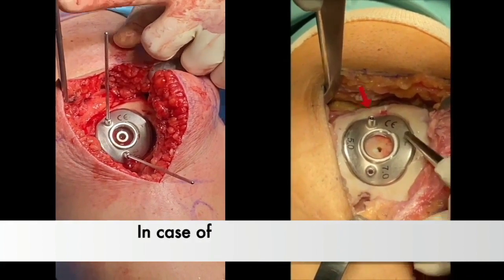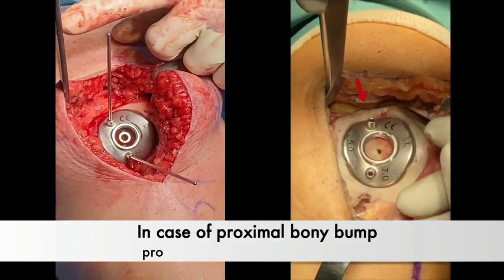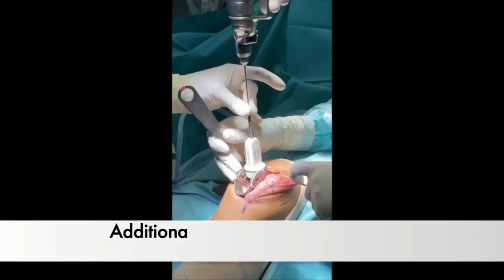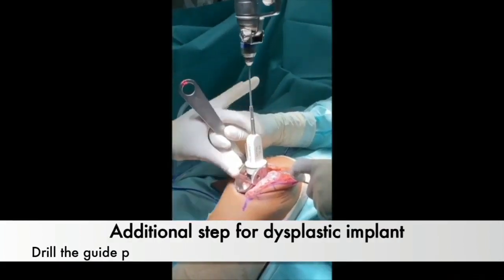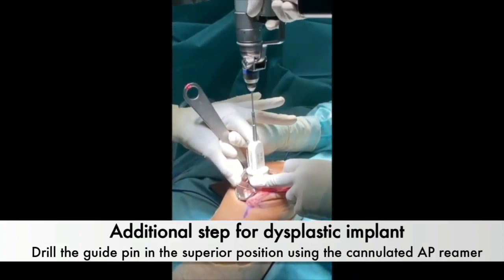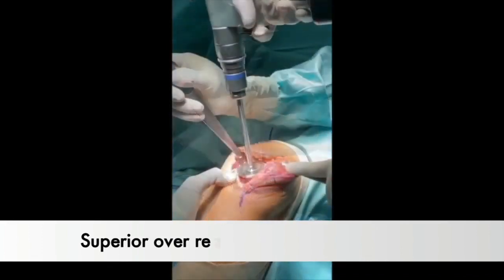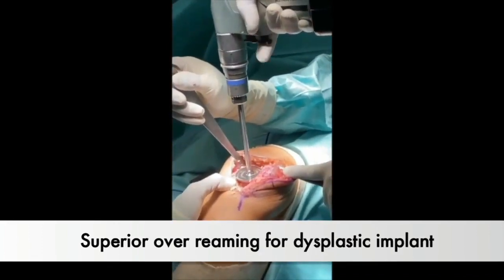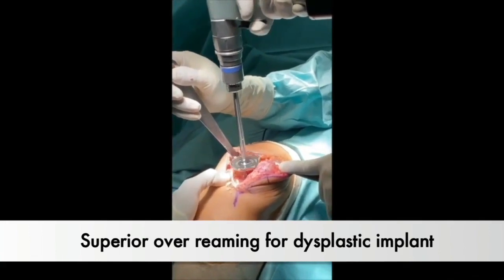At this point, determining the need for a dysplastic implant involves observing the presence of a superior bony bump proximally over the trial. In such cases, an additional step entails guiding a pin through the cannulated AP rimmer to the proximal trochlea, followed by superior over-rimming with the specific umbrella-shaped rimmer for the dysplastic implant.